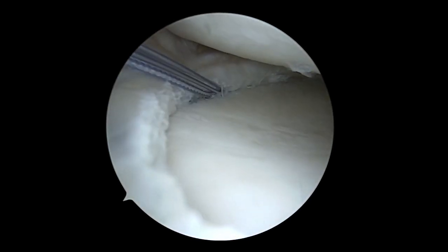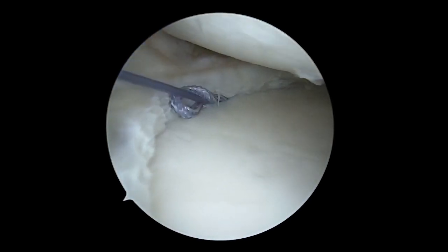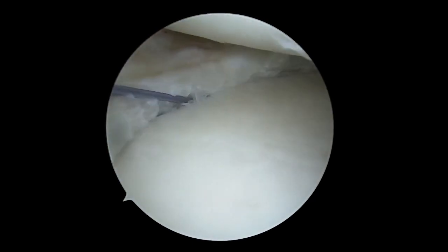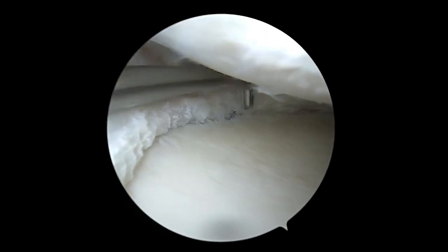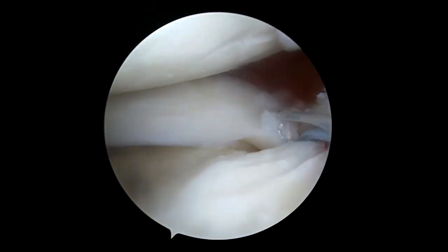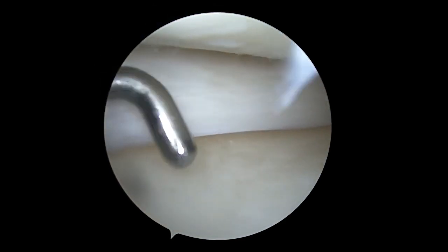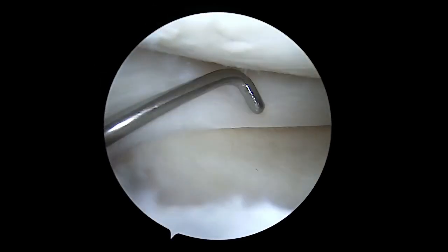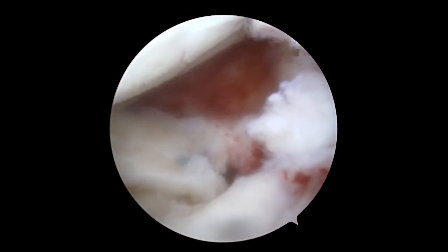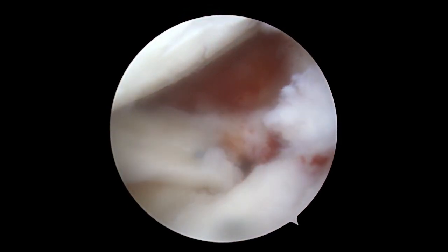The tibial anchor repair stitch is again fed through its knotless mechanism and provisionally tightened. We can see how the meniscal tibial ligament is advanced and secured to the tibia. The meniscus allograft is then passed into the knee using sutures pulling from the posterior transtibial tunnel. The graft can then be fixed as preferred by the surgeon, knowing that the capsule and the meniscal tibial ligaments have been secured, theoretically preventing extrusion of an appropriately sized graft.